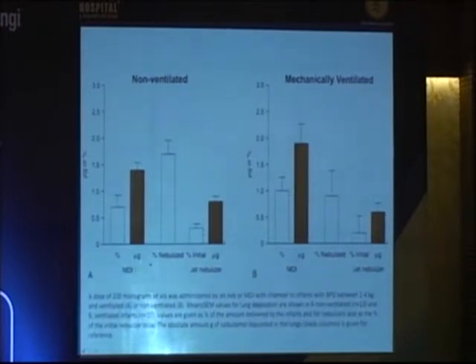So this is some really compelling evidence in spontaneously breathing patients unassisted that maybe you get more benefit using a spacer with an inhaler than a small volume nebulizer. It's certainly quicker, it's cheaper, and 90% of the patients in our hospital are receiving drug that way, rather than having someone stand at the bedside and give a jet nebulizer or a wet nebulizer.